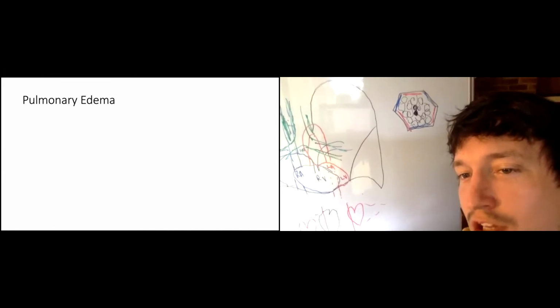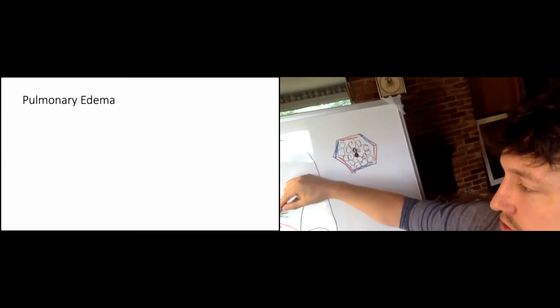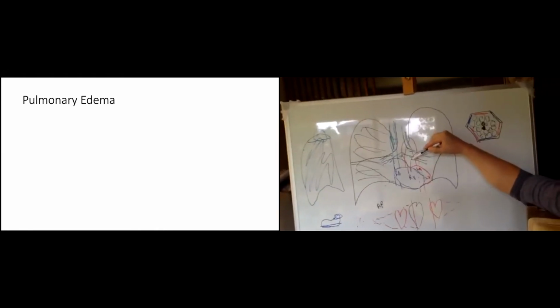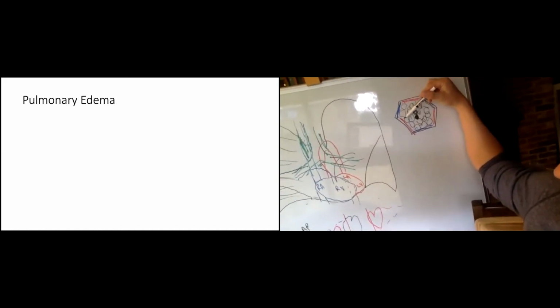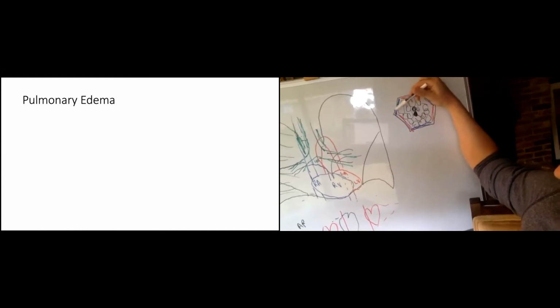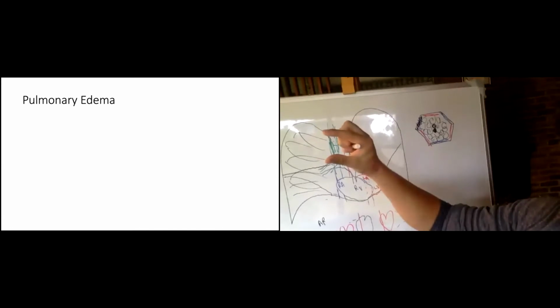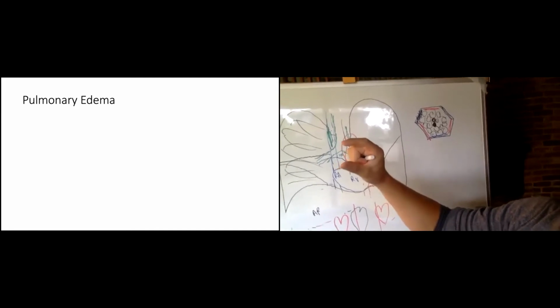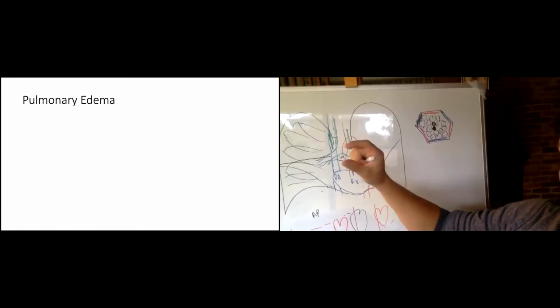Perfect. The point I want to get across from this is that anytime your pulmonary capillary wedge pressure from the heart is increasing, your lymphatics and your venous system are going to bulge out. It's going to leak. So the first thing you're going to get is these are going to increase in size, but it's going to be very smooth looking. If you see on a CT smooth interlobular septal thickening, that's the descriptive phrase they use. That's more like pulmonary edema.